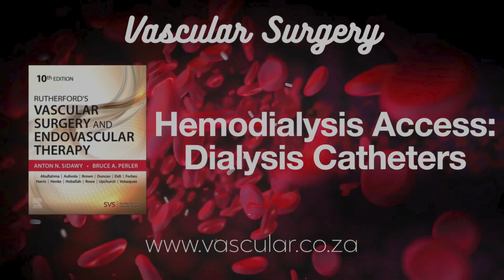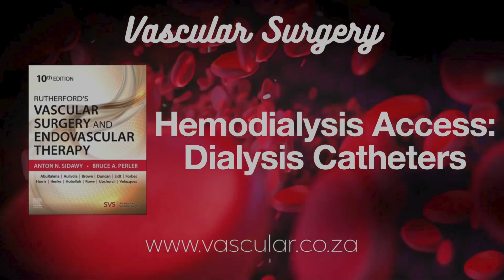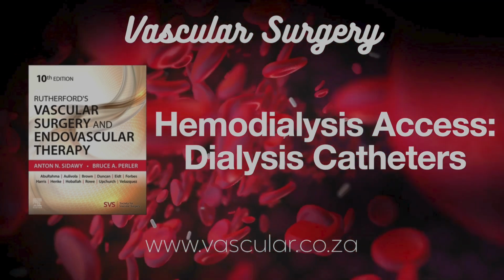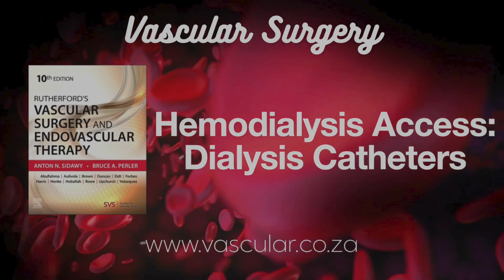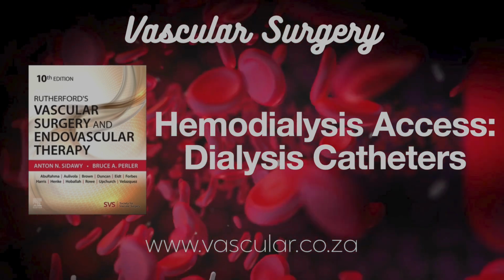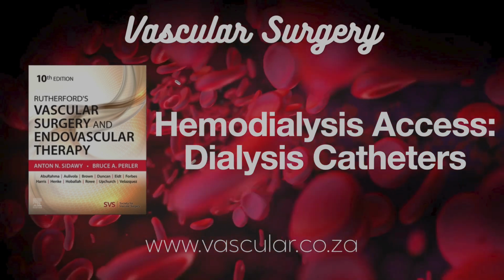Catheter occlusion, blockages. You said that's common. Very common. Maybe 30–40% get some degree of occlusion. Usually it's a fibrin sheath, kind of a sock of clot material forming over the tip. Early warning sign: often it's difficulty drawing blood back, even if you can still flush fluid in. That usually means trouble's brewing.